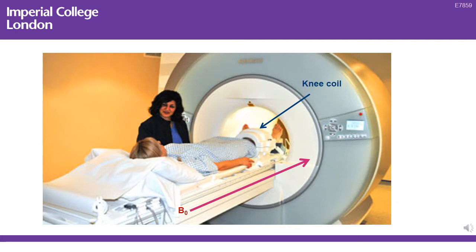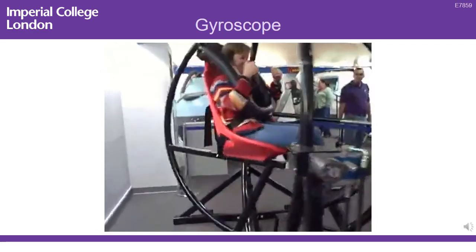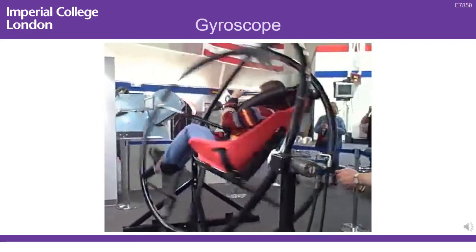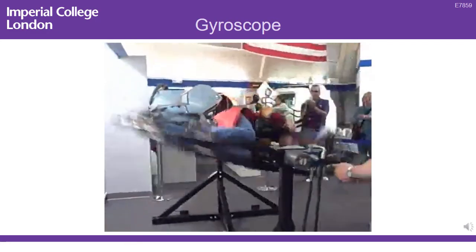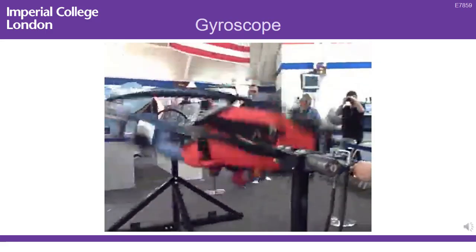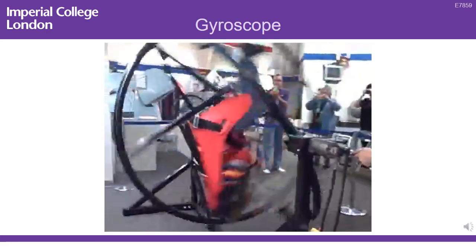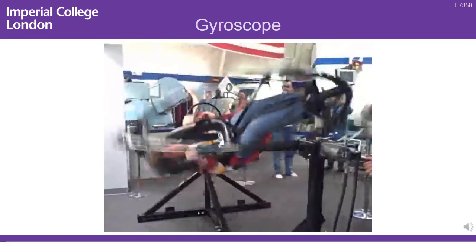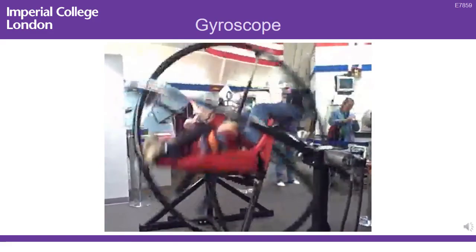So how do you scan a patient harnessing the magic angle effect? One of the initial ideas was to make everything move: the patient, the magnetic field, and the coil. Like the gyroscope shown here, gyroscopes have 2 or 3 gimbals so that the spin axis is free to assume any orientation by itself. How many gimbals are in this example?